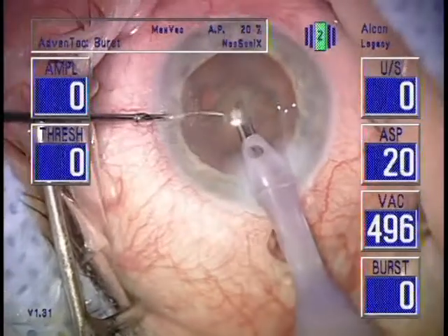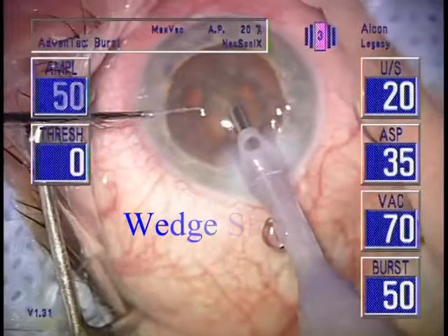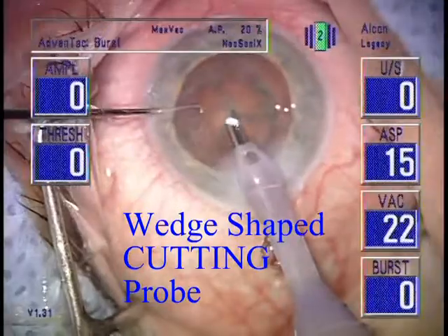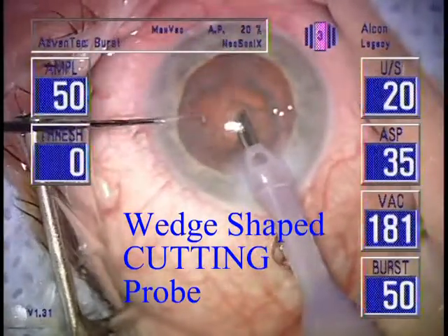The Safety Bevel Probe occludes more readily than any other probe. It has the same wedge-shaped continuous cutting edge as a corneal trifine, only with an angulated orifice.